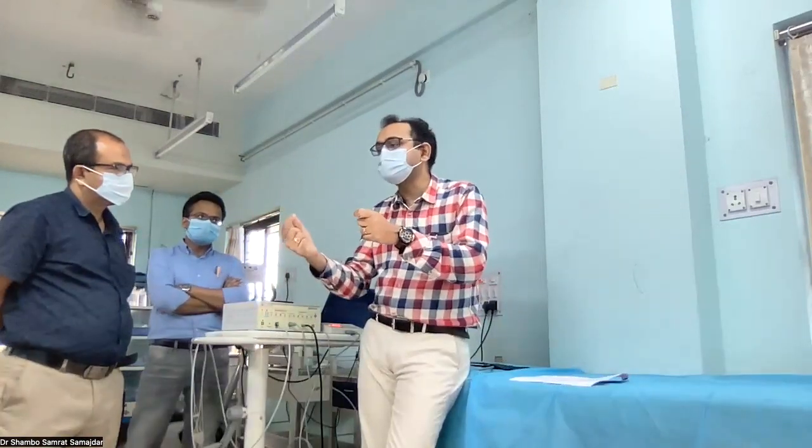In that long lead ECG, we have to find the shortest RR interval, and along with that, we also need to find the longest RR interval. Then we need to calculate a ratio: the longest RR interval divided by the shortest RR interval. If this ratio is more than 1.2, then we can call the report normal. So that value, 1.2, is very important. The Valsalva ratio is defined as the longest RR interval divided by the shortest RR interval.